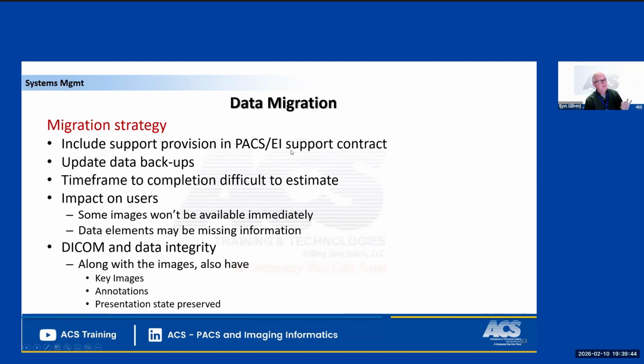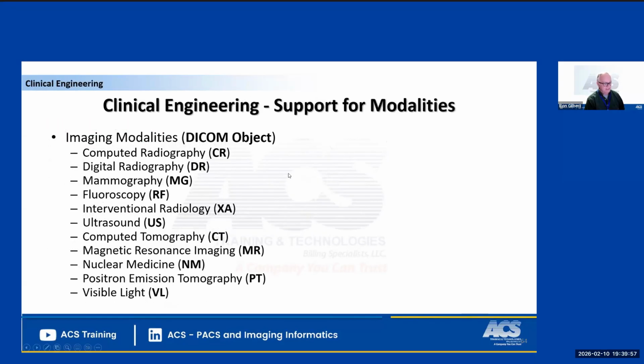So you're going to learn, one, to get the data from one place to another, but then also to tell whether you got it all and whether it is usable. And if not, you make them go do it again or find out what to do. Now we get into clinical engineering, with the support for the modalities. This is the DICOM objects. We're now looking at them as objects. We're not looking at them as data flowing on a wire.